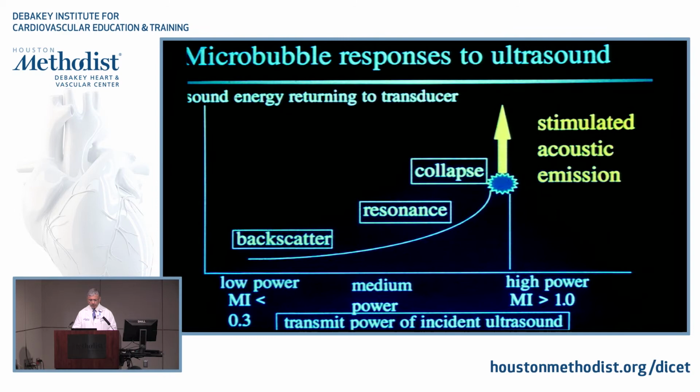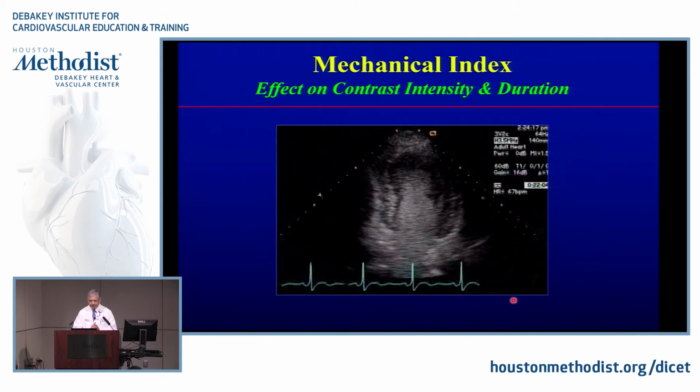One more time. I wanted to make a case for you. There you go. How do I know that I didn't use too little contrast? You see here, it's not filling, right? See how poor the contrast is? Do I need more contrast to inject in this heart? Yes or no? How do I know that?